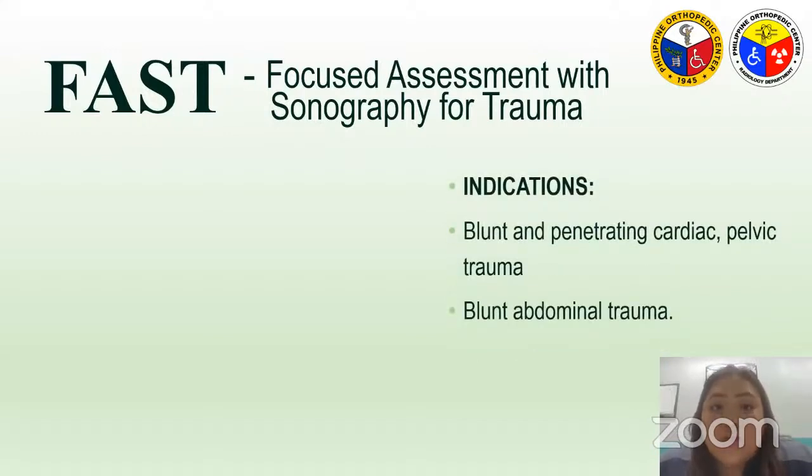So again, I would like you to know that FAST means focused assessment with sonography for trauma. It is a non-invasive test that can be done rapidly. It evaluates for the presence of intraperitoneal free fluid in the abdomen and pelvis. In addition, cardiac views allow for detection of cardiac injury and pericardial effusion.